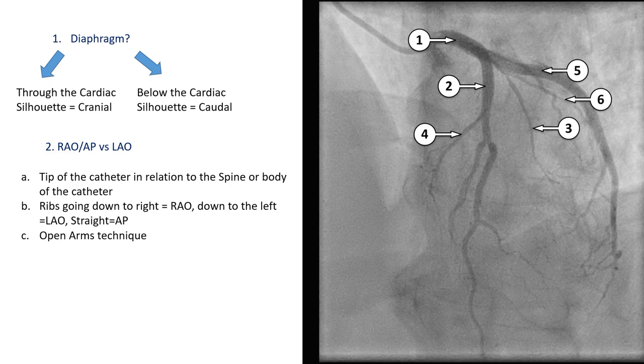So cranial, so it's going to be up and left, which is the case here. When we say left, it's the same way when we look at the chest x-ray and the left lung is somewhere here and the right lung is somewhere here. So this is circumflex, left main stem, LAD, and circumflex. So the answer was number 2.